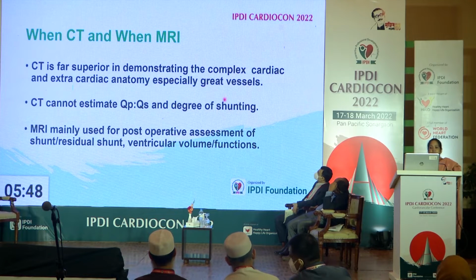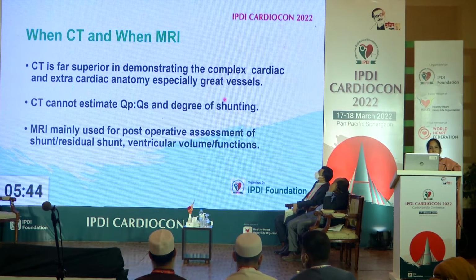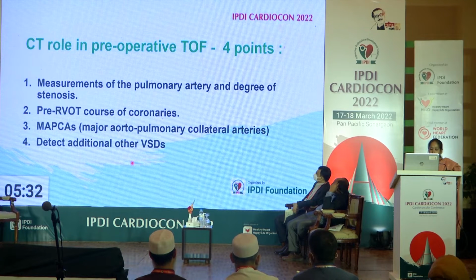CT is superior in demonstrating the complex cardiac and extracardiac anatomy, especially the great vessels, but cannot measure the Qp:Qs. And MRI is mainly used in post-operative assessment, especially residual shunt, and to determine the time of pulmonary valve placement. So pre-operatively, CT has 4 important roles.